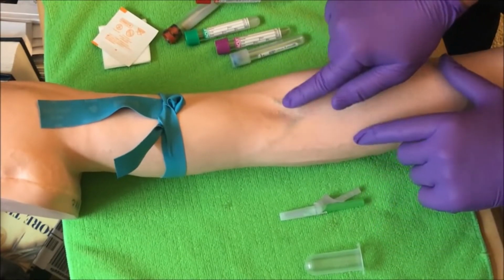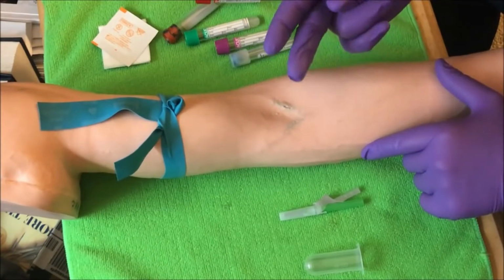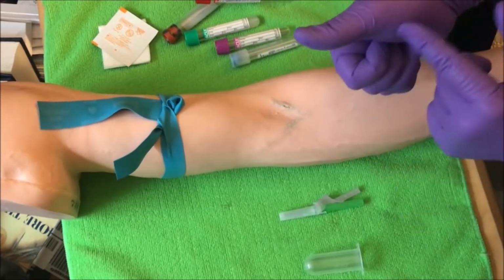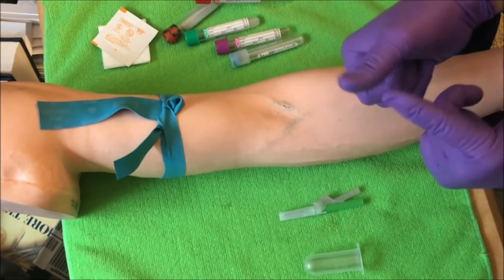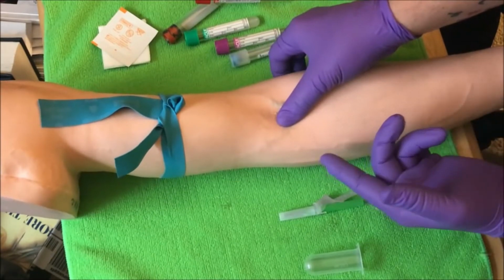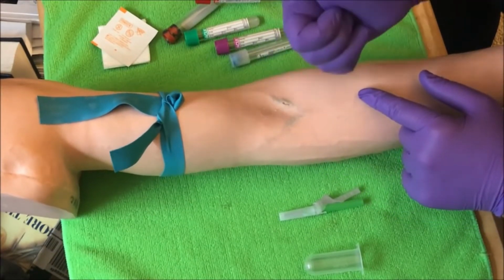Now, I like to palpate. What I like to do is push down with my index finger here. Some people like to use the middle finger, which is fine. I don't use the thumb. Because of the radial artery, you can get a pulse on your thumb if you're doing this, and you might think you're hitting the brachial artery when you're not. So I want to make sure that I don't use a thumb.